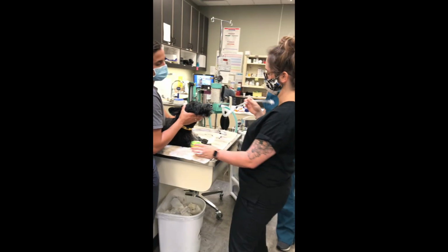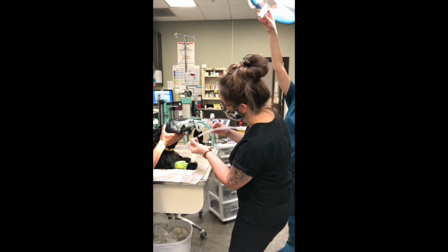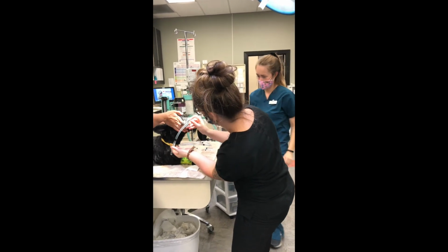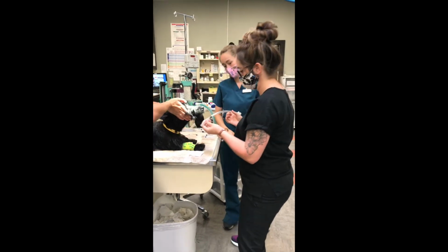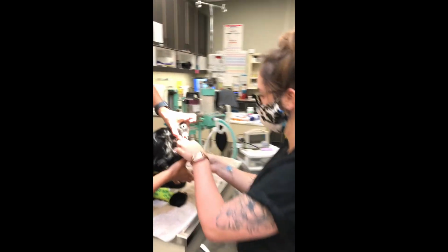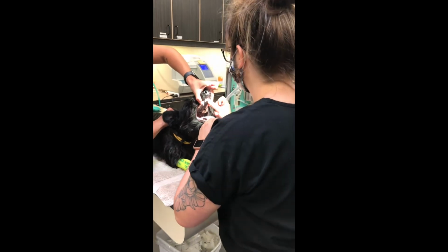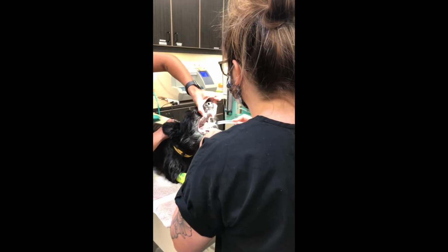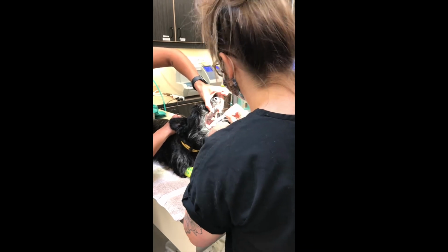Going to measure. Okay. That looks fabulous.